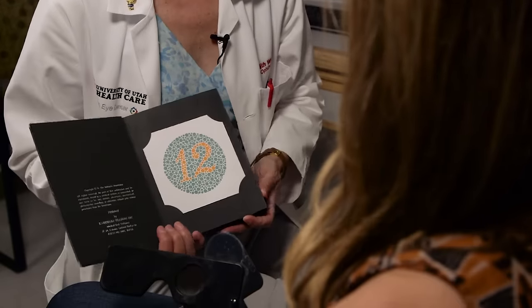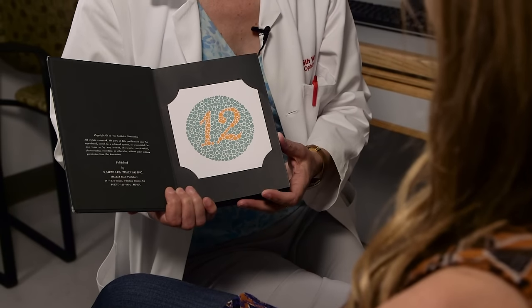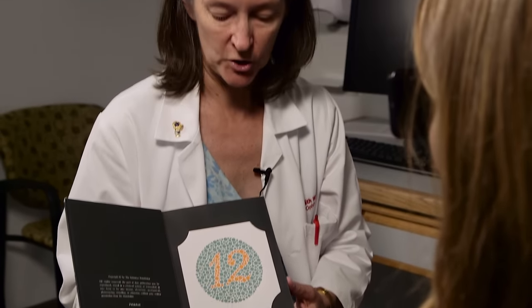The next thing we move to is color vision testing. Some people use the Ishihara color plates, some use the HRR color plates, there's a variety of others. I happen to prefer the Ishiharas — you stick with what you're trained with. Hold that up looking with your right eye. The first plate is a control plate; it does not actually require color vision. It's very large, so people with even extremely impaired vision — 20/100 or 20/400 — can see this gigantic number.